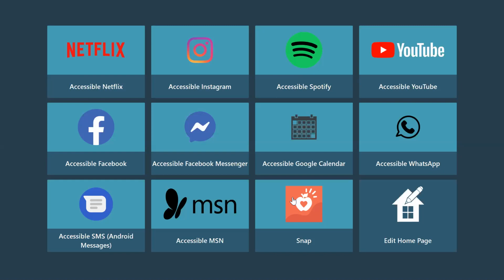Just a quick side note, this is only available for the newer iSeries, the i13 and i16. It is not available for the older iSeries models, so your i12, i15. It's not going to be available for touchscreen devices, so your i110, that's running Communicator 5.